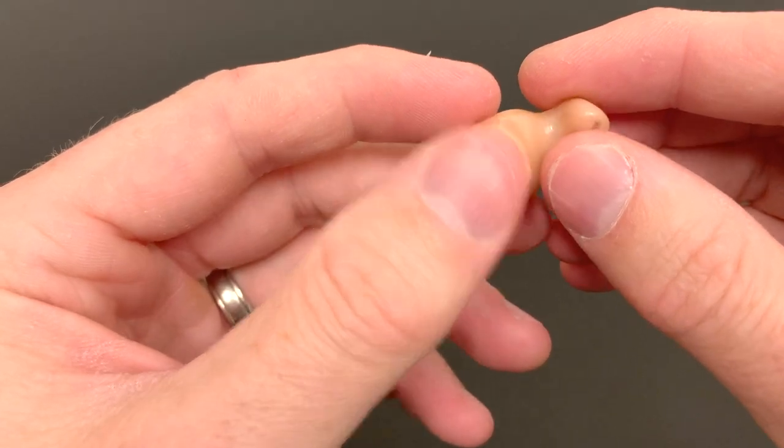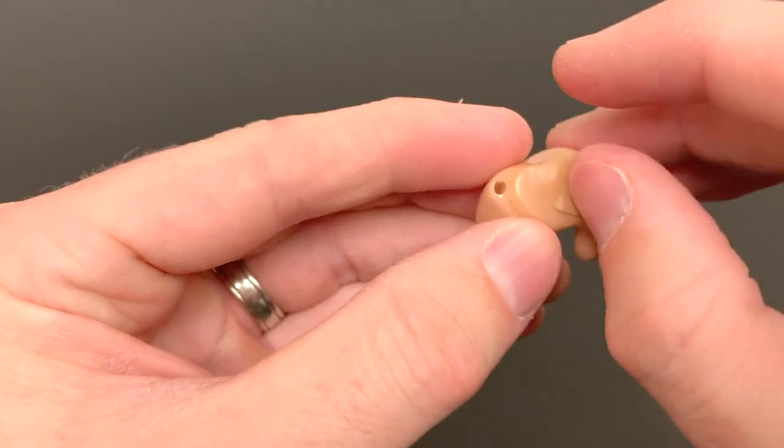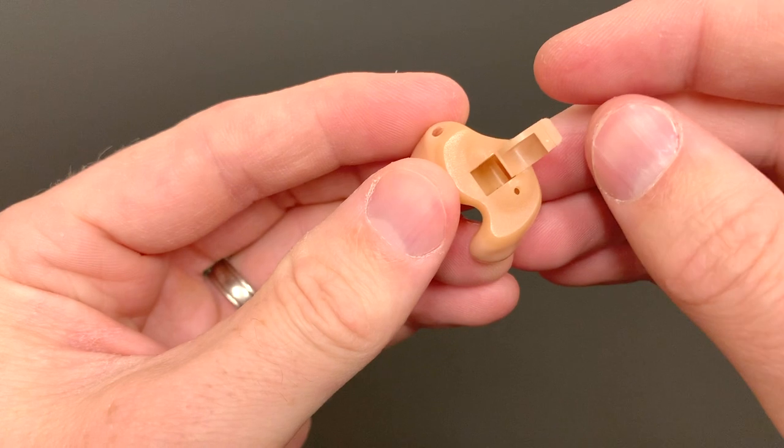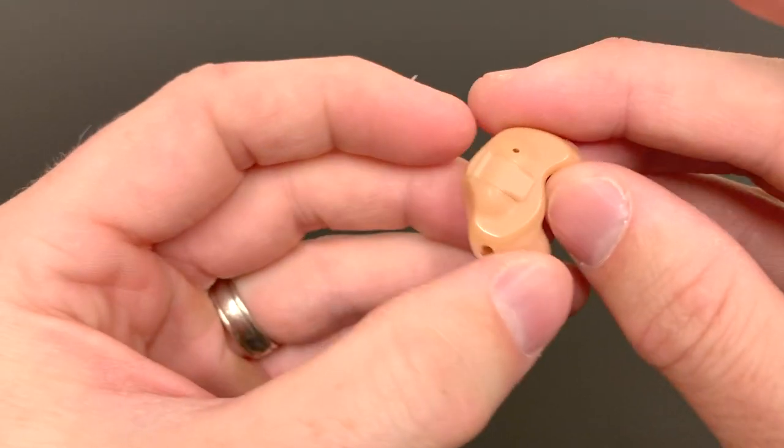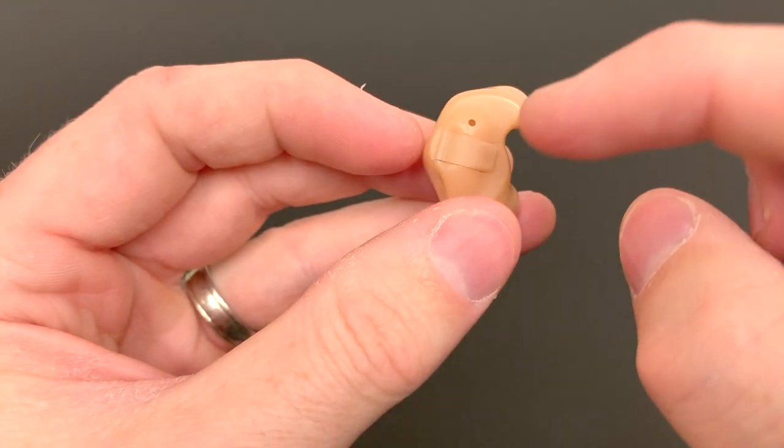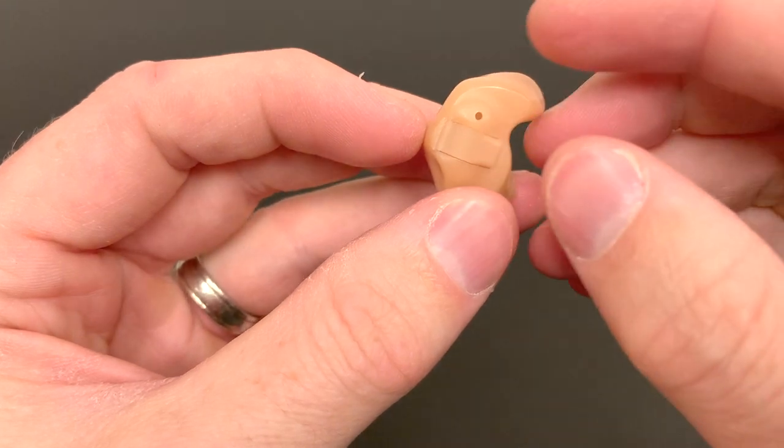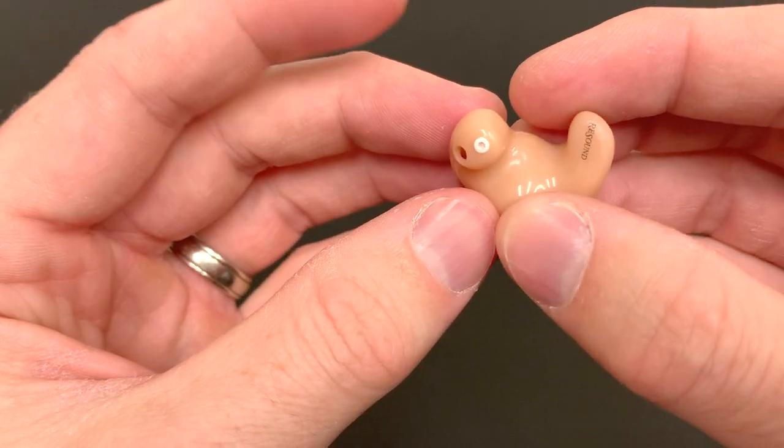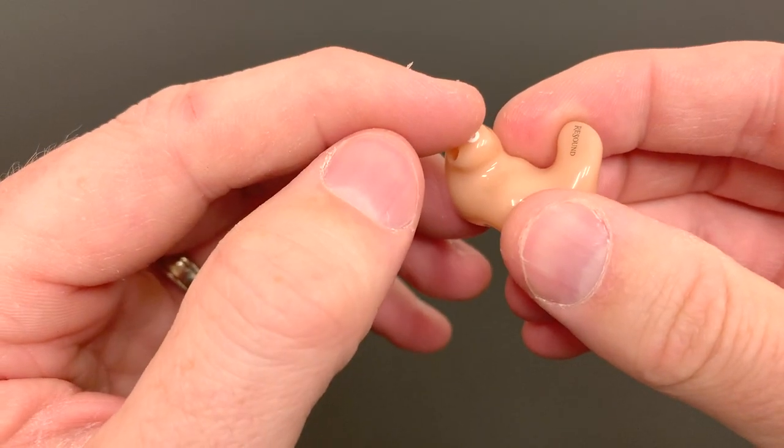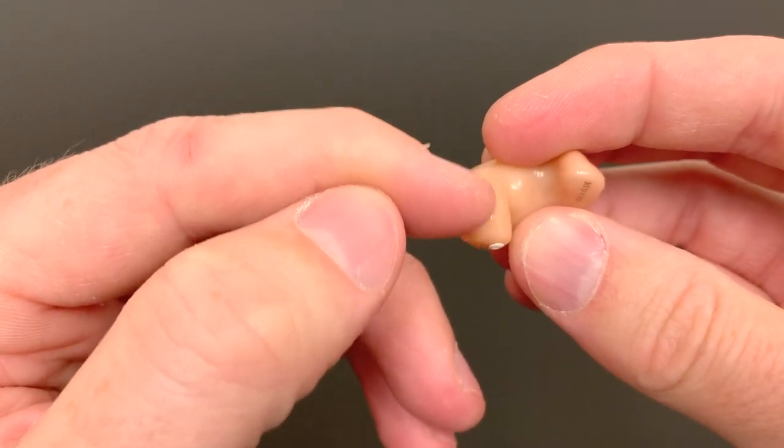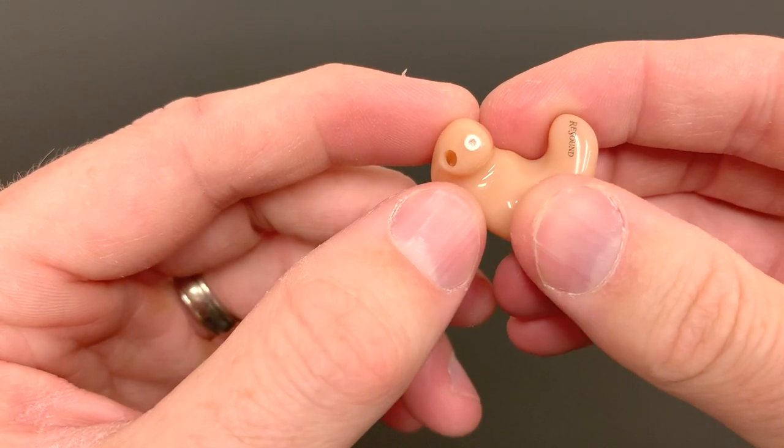This style of hearing aid has the battery door on the outside here that opens that way. Your microphone port, where the microphone lives, is here at the front. And if we turn the hearing aid over, you'll see again, there's that wax guard and the receiver or the speaker unit is inside the hearing aid here.